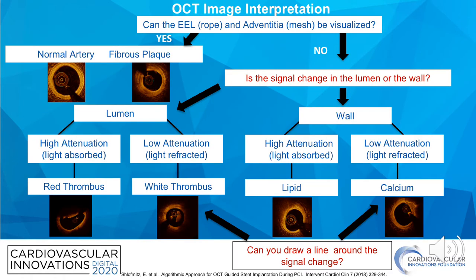To determine what type of plaque is present, the first thing you want to do is evaluate if the EEL, or external elastic lamina — that outer dark portion of the media — can be visualized. If it can be visualized, it's either a normal coronary artery segment or there's fibrous plaque. If you cannot identify the EEL, the first thing you want to do is determine if the signal change is occurring in the lumen or in the wall.